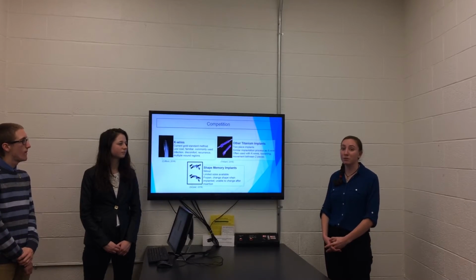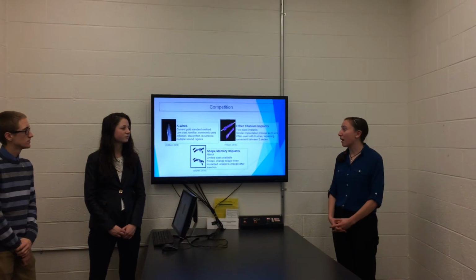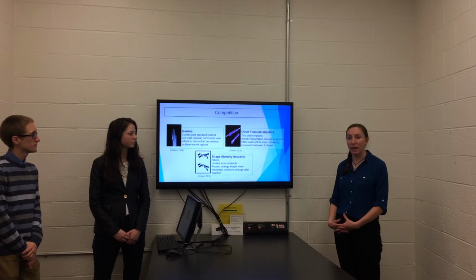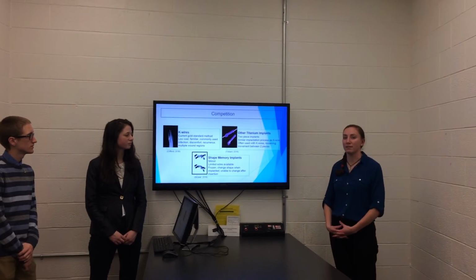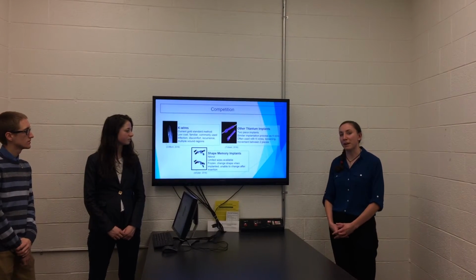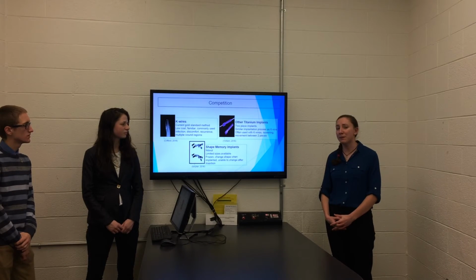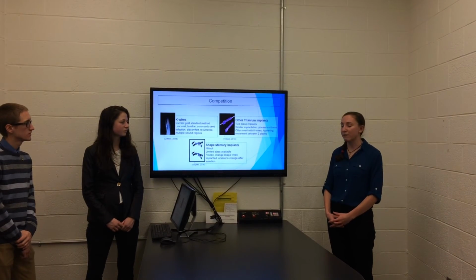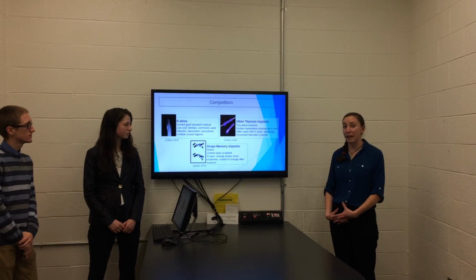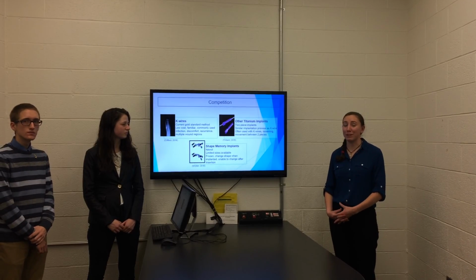Most of these implants are two-piece implants and can often be cannulated for use with the K-wires. They also have a tendency to loosen or rotate and cause movement between the two pieces, which causes complications for the patient. And finally, there are shape memory implants, which are made from nitinol. These shape memory implants are available in limited sizes and are slightly inconvenient because they have to be frozen for 2 hours before insertion in the foot, and they cannot be changed in shape or orientation after the shape change has taken place.